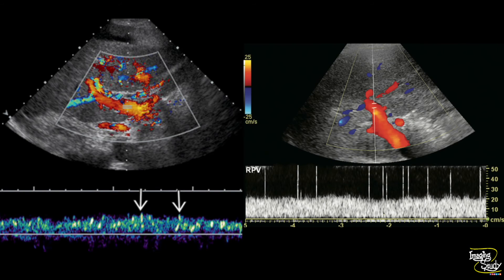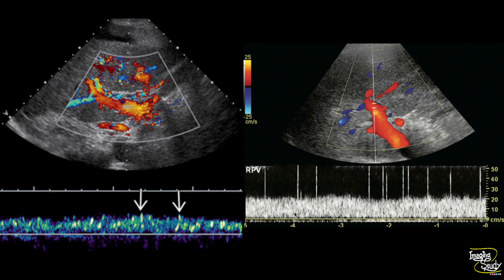Here is another case with pulse wave Doppler in a patient with portal venous gas secondary to small bowel ischemia and pneumatosis, showing strong high intensity transient signals superimposed upon the portal vein waveform in the same direction as portal venous flow. On the right, the spectral Doppler tracing in a patient with pneumatosis intestinalis shows spikes caused by air bubbles traveling at the same velocity as the blood; the intense sound reflection from passing air bubbles creates spikes of noise.